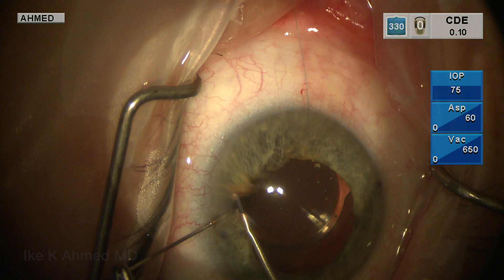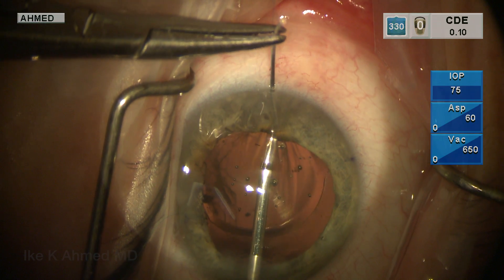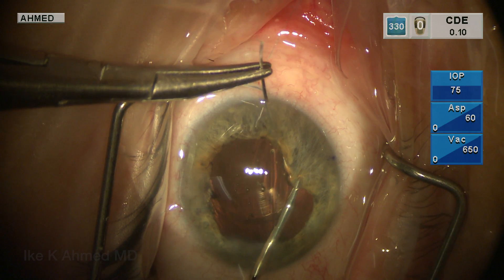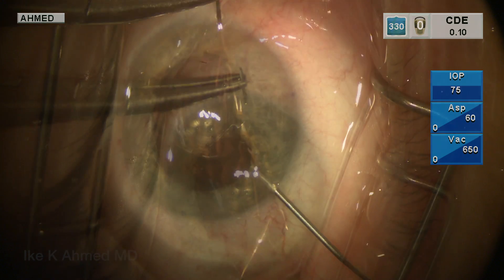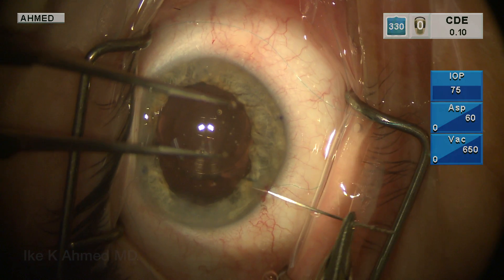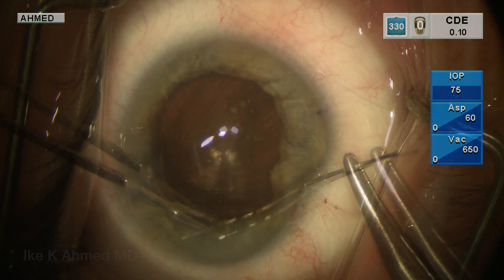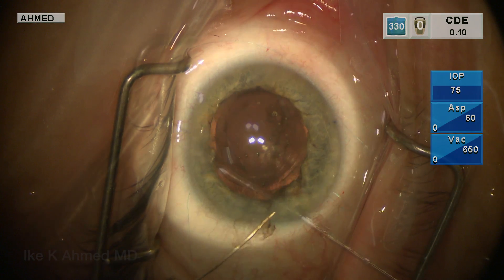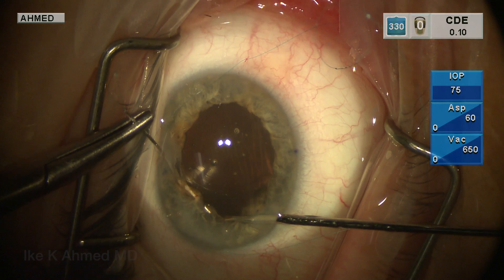We will then place the needle through an adjacent paracentesis with the use of a docking needle to prevent any entrapment of corneal fibers. Notice that the bites are made approximately a half millimeter from the pupil edge and approximately a millimeter apart. This will help to round out the pupil as much as possible. You can see how we switch hands here — our left hand is holding the needle while the right hand is holding the micro-grasper. The needle is docked to a 27-gauge cannula and then removed through a paracentesis. Notice how we place these paracenteses one-third of the way around the limbus to allow the needle to be passed along one-third of the iris. We will then pass both needle ends again back into the eye through their respective paracenteses back through into the main incision.